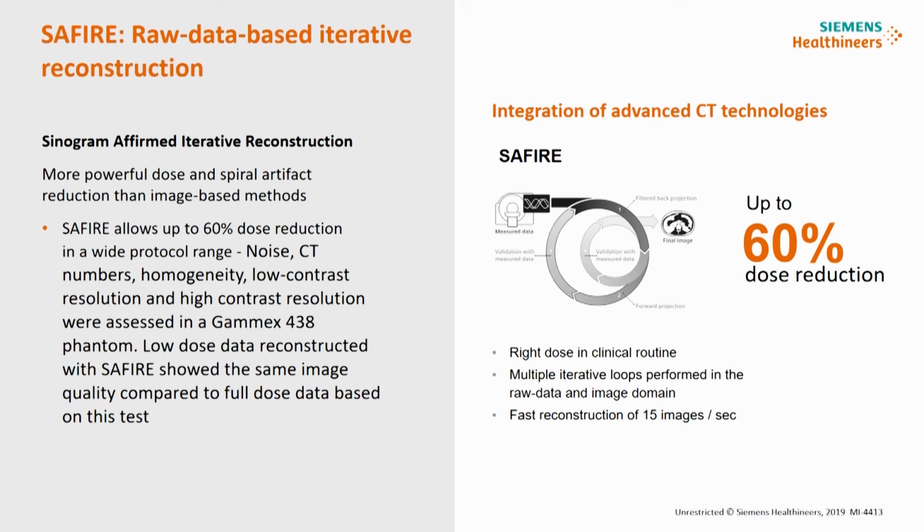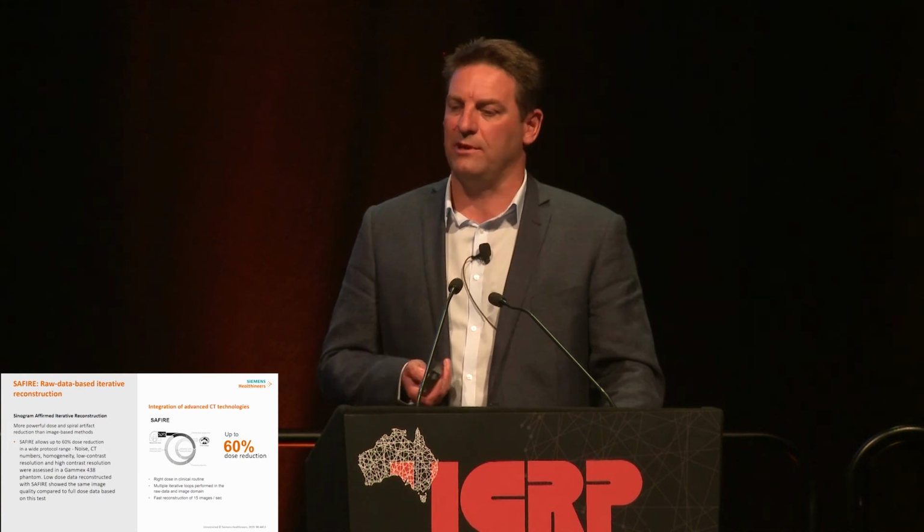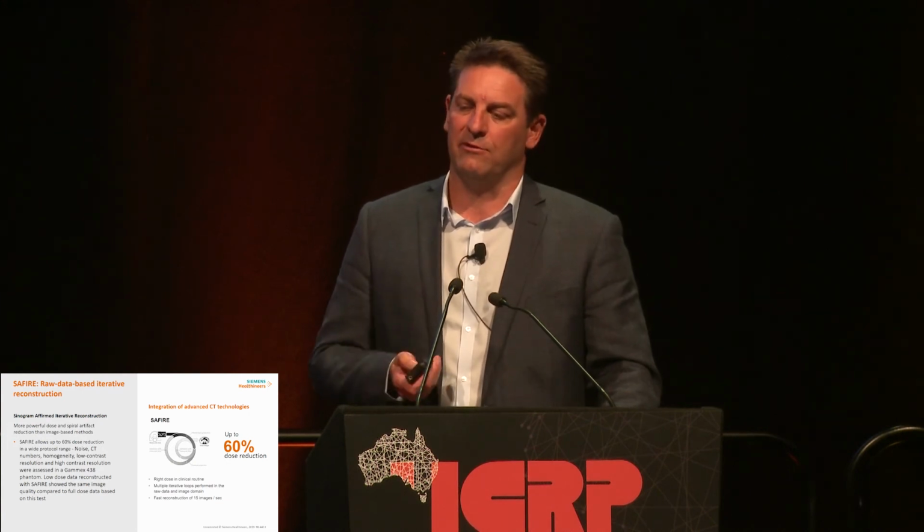Iterative reconstruction techniques have improved significantly over the last few years, and we've seen about a 60% reduction from the initial systems. We were able to get much lower dose but improve the image quality using multiple iterative reconstruction loops in the raw data and the image space.